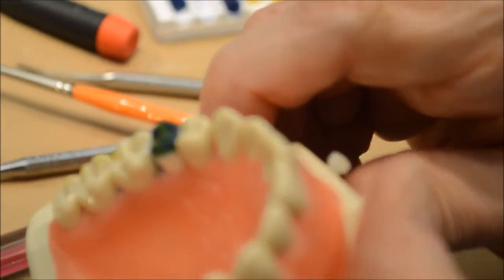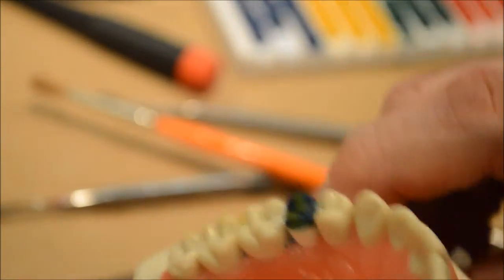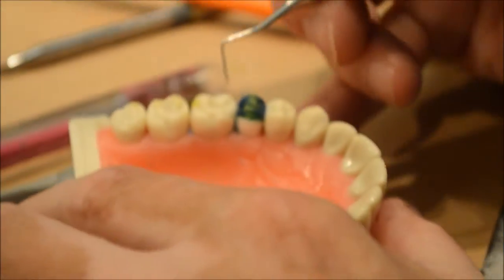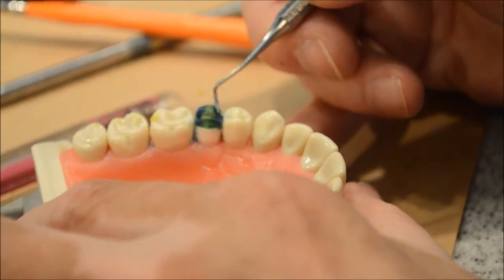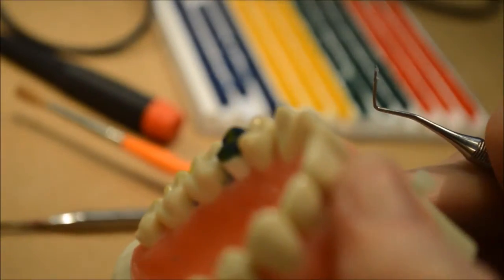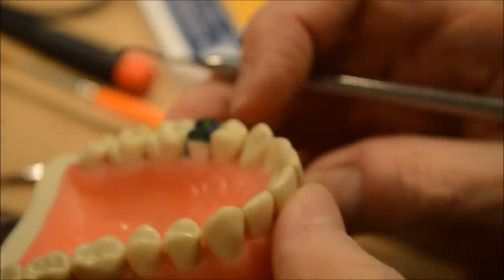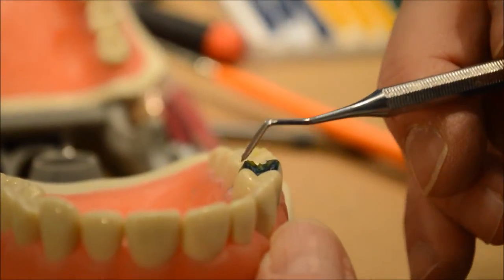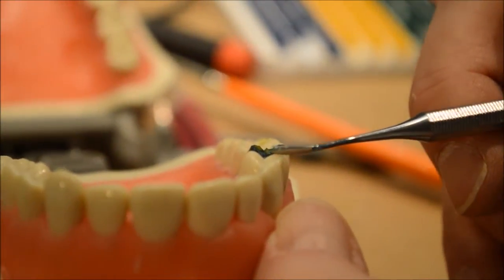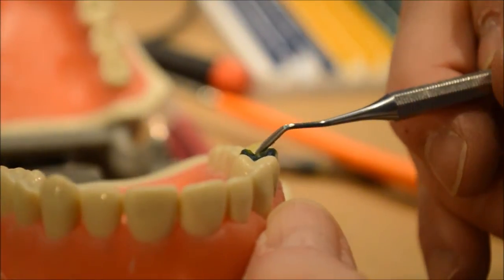Now I'm going to check to see if my cusps are too long. I think they are, so I have to cut this down a little bit. What I'm doing is looking down with one eye to see if this cusp and this cusp are the same height — that's what I'm looking for.